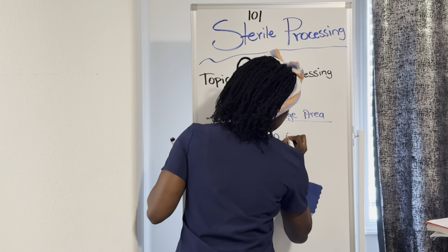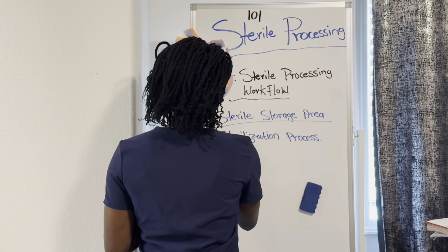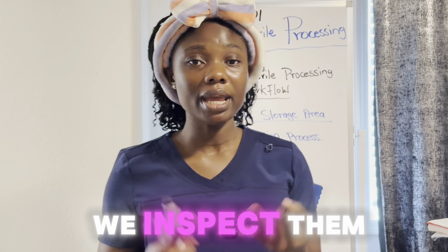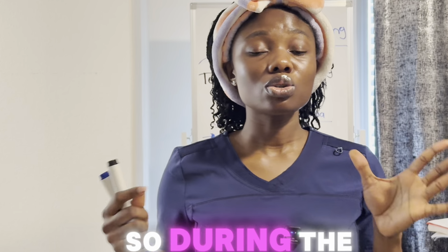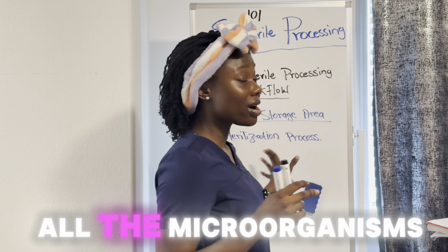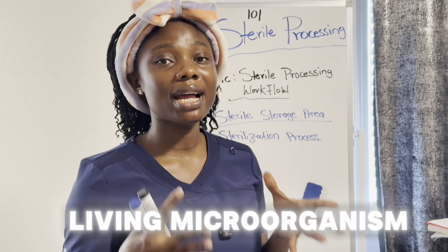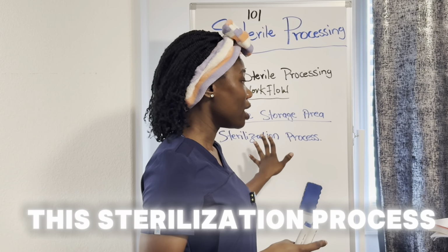So the sterilization process is where the instrument goes through the autoclave. So we take the instrument that we decontaminated, that we assembled, and inspected, and then we put it into the sterilizer so it can go through the sterilization process. During the process, the sterilizer is going to kill all the microorganisms on the instrument that we cannot see with our naked eyes, especially spores. It also kills the fungus. It also kills any living microorganism that is not good to come in contact with the human body. That's what the sterilization process does.